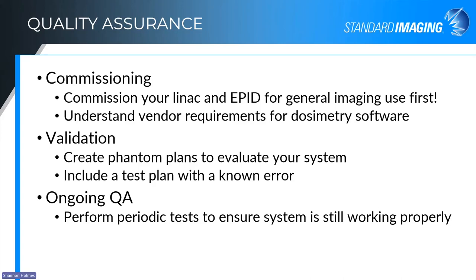Once you're comfortable with those accurately delivered plans, it takes time and it takes effort, but make a test plan, or a couple of test plans, with known errors in order to test how well your system picks that up. There are variations in sensitivity for different sorts of errors, and it's good to understand both the strengths and the limitations of your new dosimetry system so that you know what to expect and what to follow up with when an error does show up on a patient treatment.